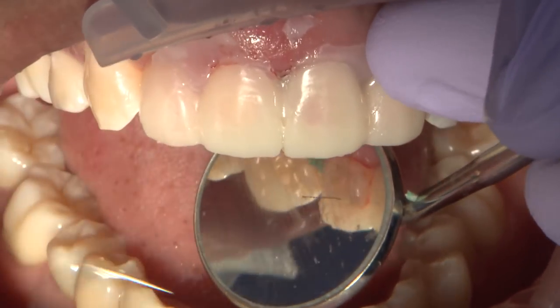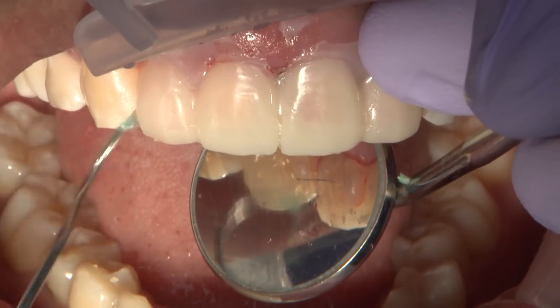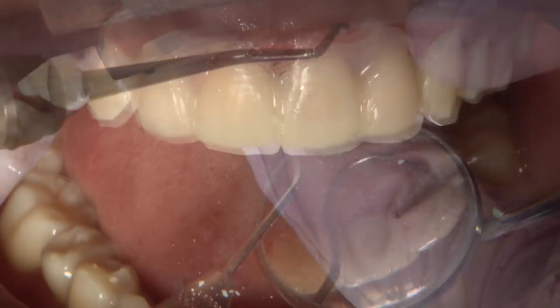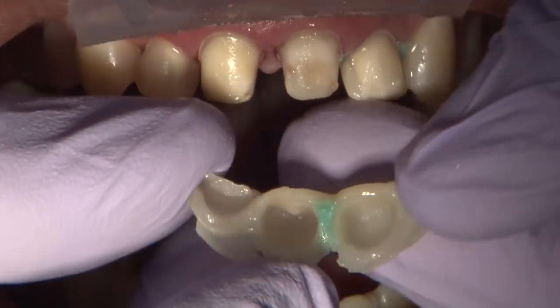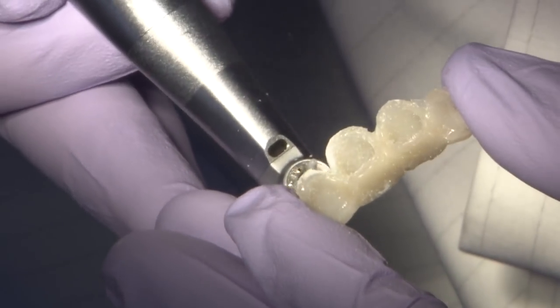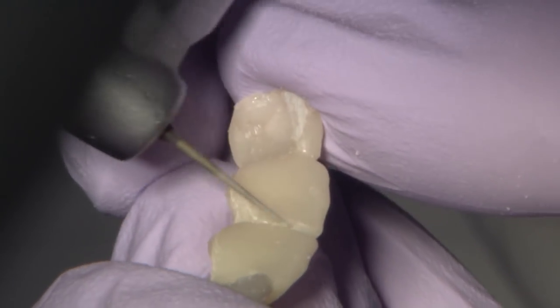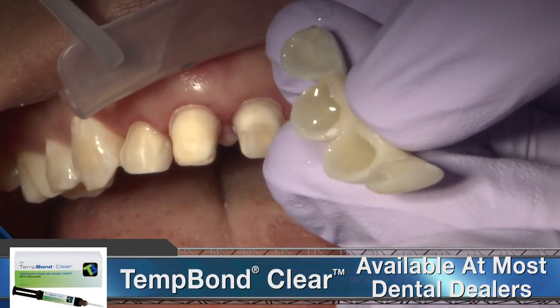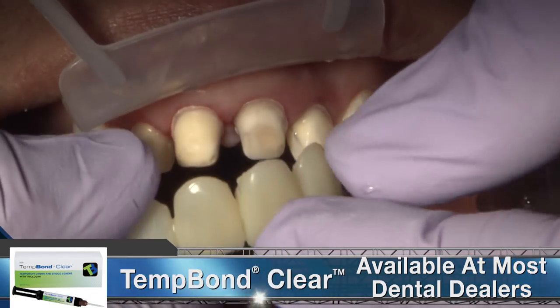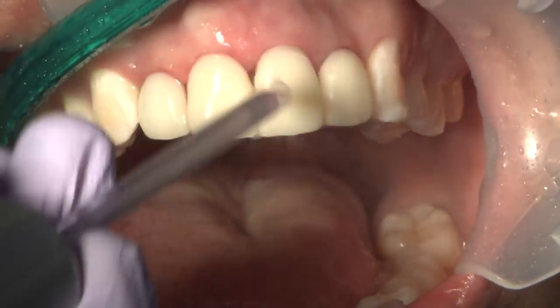Once set, the blockout resin can be gently punched out of the interproximal areas to clear the path of initial removal. Additional blockout resin that sticks to the BioTemp can be easily removed with a spoon excavator or a handpiece. Once again, minimal flash removal and reshaping is necessary before final seat of the 4-unit crown veneer BioTemp combo. In these combination cases, Temp Bond Clear is my cement of choice to adhere veneer units and prevent opacifying of matte shaded temporary cements.